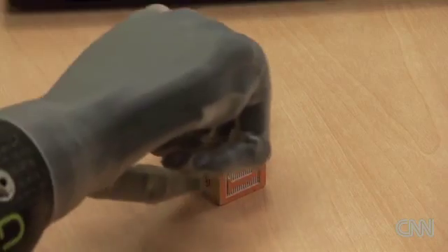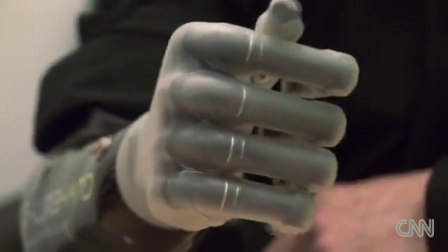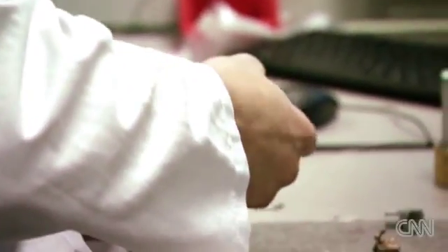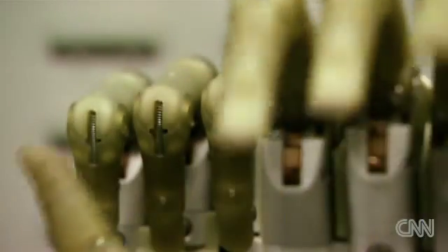According to Gao, there are about 4,000 I-LIM users in the world, but the potential market is huge — an estimated 2 million upper-limb amputees. Touch Bionics is looking to take its share. Sales are accelerating; in 2012, turnover reached over $16 million.